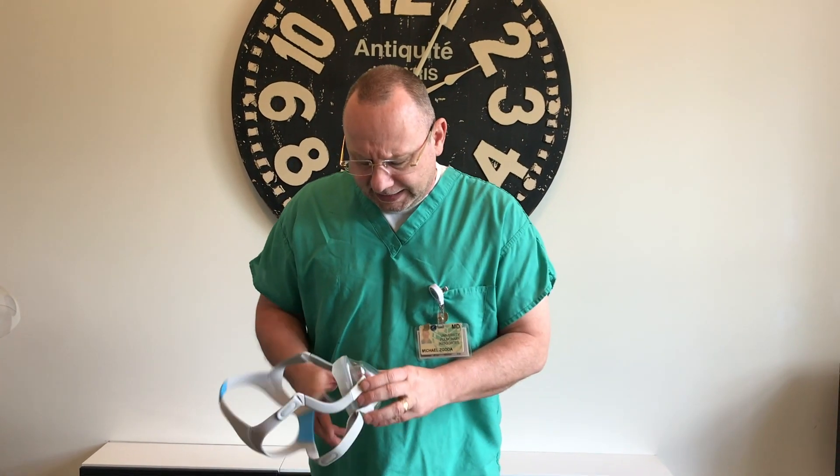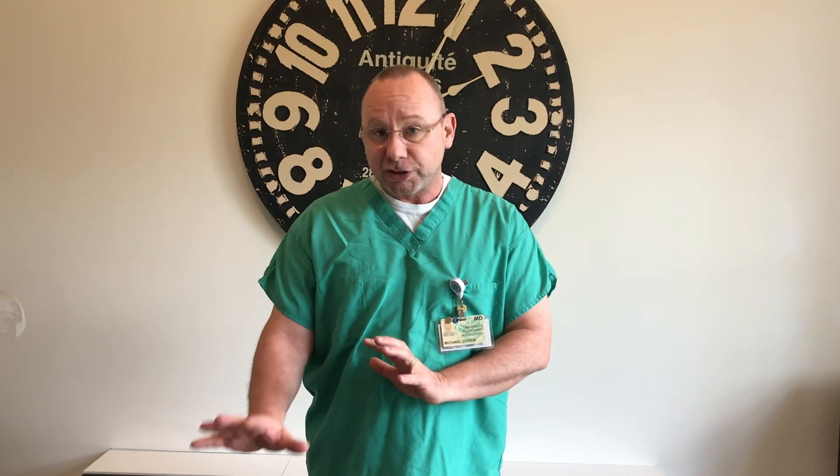However, I was rounding in the ICU this morning and as I was going through things I saw that there's an opportunity for us to actually make something that is probably just as good. It's not going to be as comfortable but it's going to be just as functional, and you're going to have a lot more access to these parts — more so than a CPAP mask.